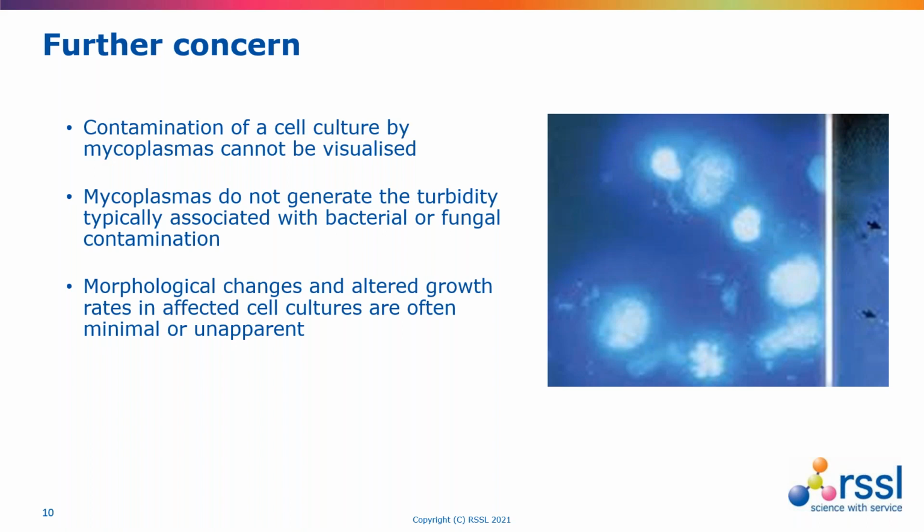It can also be that even studying the cells themselves or carrying out the typical tests on the characteristics of the cell culture, some of the morphological changes are not immediately apparent, and some of the altered growth rates can be minimal or simply unapparent, but they can still cause the cell culture to lose whichever property or test it is involved with. So there's an additional concern there.